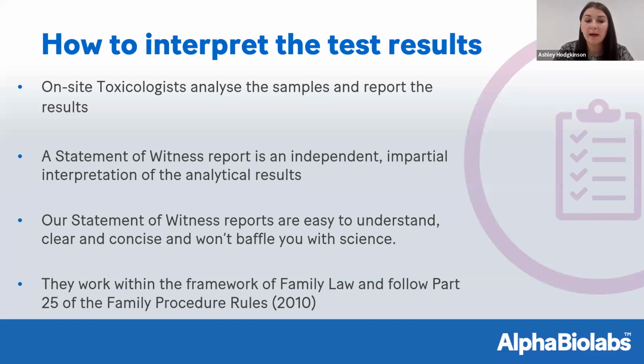This is a very basic report, and it's for people who just want the facts and the figures of what we found. Again, this is useful similarly to an overview if you're just looking at finding out a base result, so where your client is starting, if they're going into a program of recovery, potentially to do a comparison in a further 6 months' time, or if you know that your client will be negative, so if they've abstained or never used drugs, and you just need that negative result.